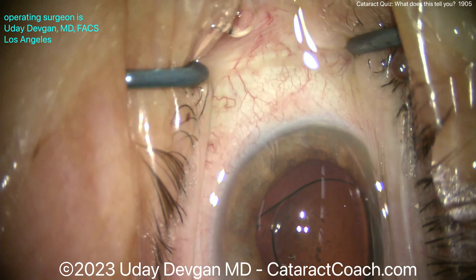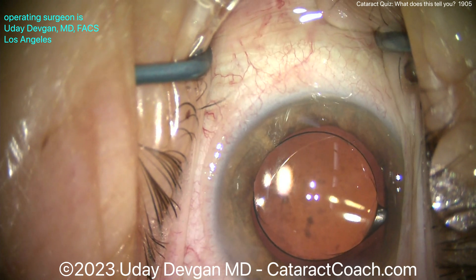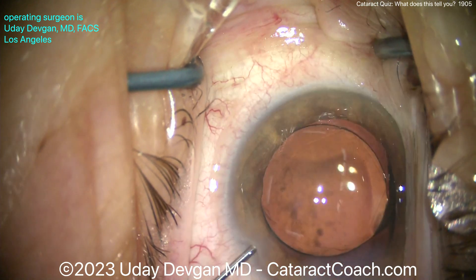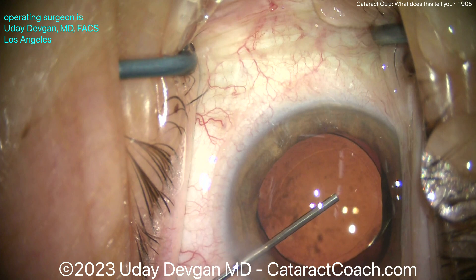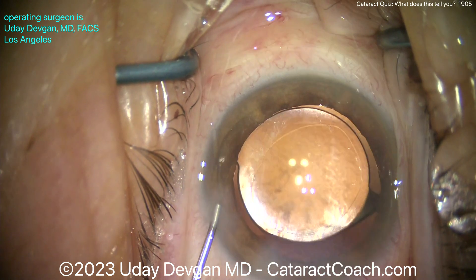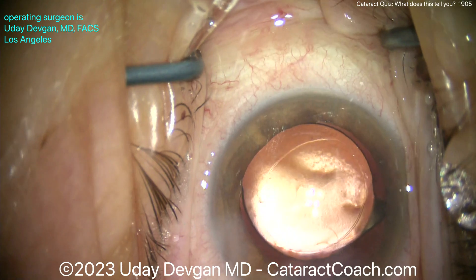That was less than ideal — I don't want the AC to collapse like that, so let's refill it. I'll double-check to make sure there's no vitreous prolapse, and let's get that incision sealed up. An option would have been to seal that incision prior to placing the I/A probe when evacuating viscoelastic. The lens looks pretty good — it's centered up nicely, overlapped by the optic for 360 degrees. The rhexis looks round, that one area looks supported. Well-centered lens, rhexis overlapping 360, capsular bag well-supported with the CTR in place.